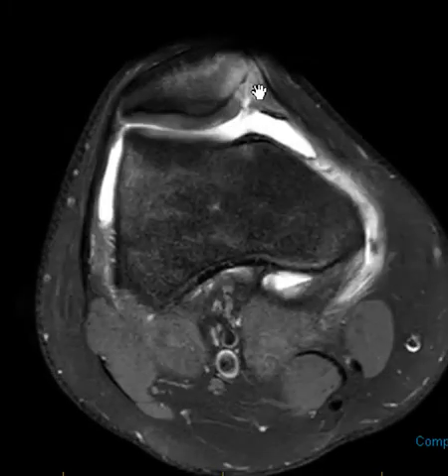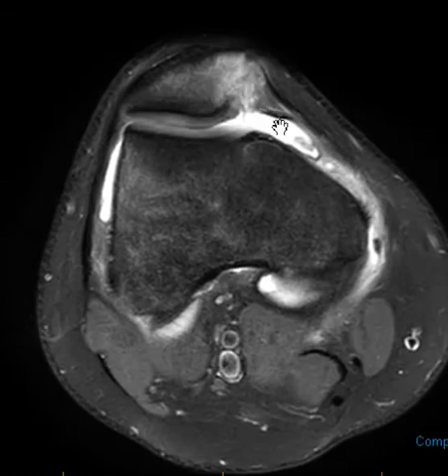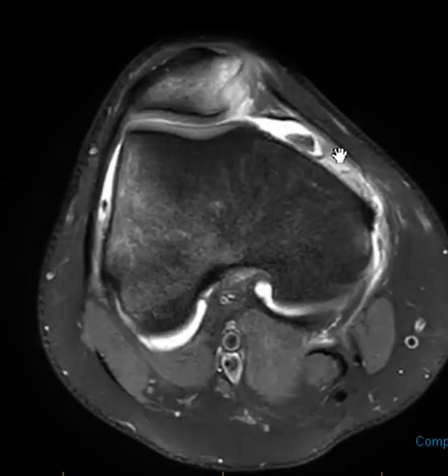Here, the articular cartilage is severely abnormal. So this little chondral fragment came from here and flipped over. So just a classic case of a transient patellar dislocation where the kneecap impacted, came back to normal position. They have a displaced chondral fragment that they need to take out. And also they have a tear, which happens usually of the medial retinaculum.